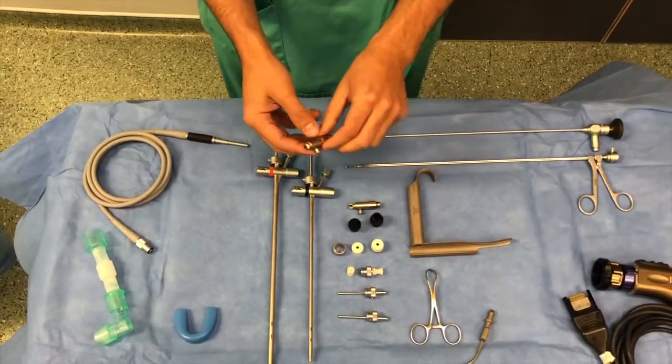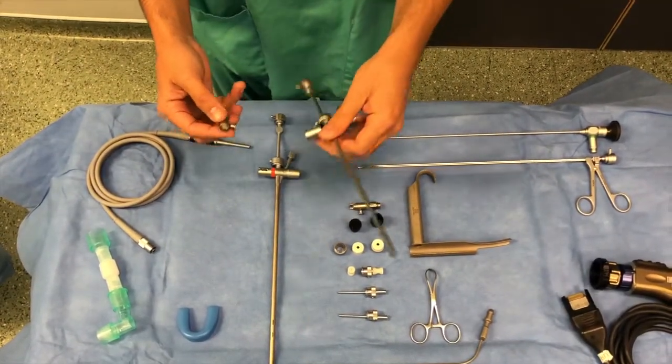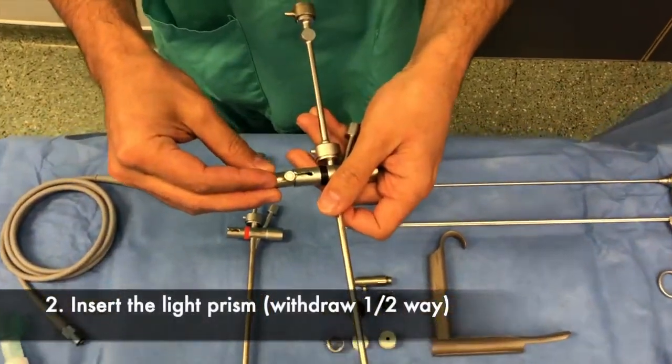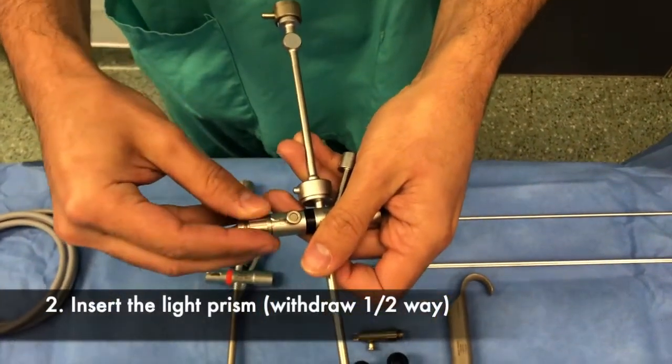Once the surgeon has selected the size of the bronchoscope, it is further assembled by attaching the light prism, which is pushed in the full length and then withdrawn halfway.